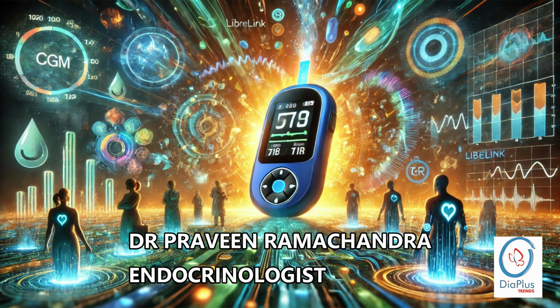What about automating insulin delivery? I've heard about this artificial pancreas. Is that actually becoming a reality? It's getting closer all the time. These closed-loop systems combine a CGM with an insulin pump, and it automatically adjusts the insulin dose based on those real-time glucose readings. It's still being developed, but early studies are showing it could really improve time in range and really lessen the burden of constantly having to monitor your glucose. I can see how that level of automation could totally transform diabetes management, especially for people with type 1.